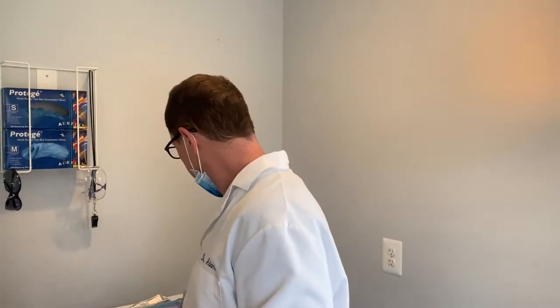And now that the patient's numb, it's a two-rooted tooth, these lower molars. I'm going to separate the tooth into two pieces so I can carefully remove it one piece at a time. And once the tooth is removed, it's really important that you remove the periodontal ligament. So we will take an instrument called a curette, and we will remove the PDL. It's almost like a peach fuzz type connection that connects the tooth to the jawbone.